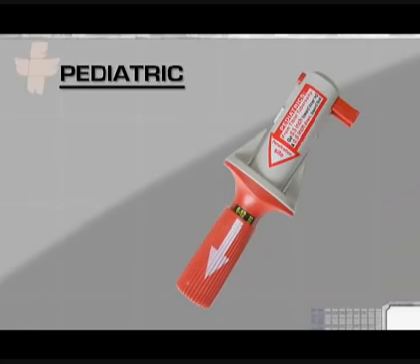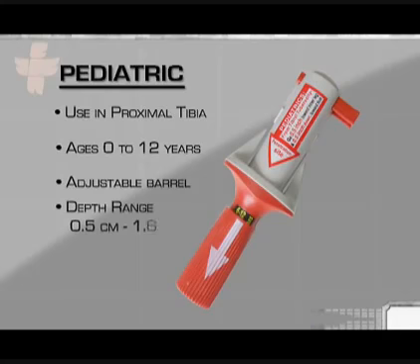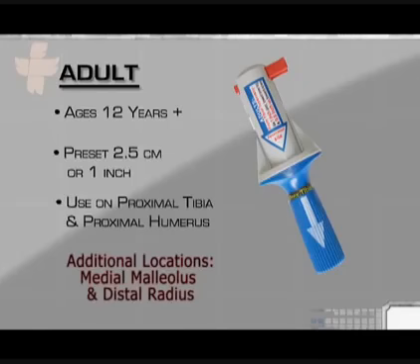The pediatric BIG is intended for use in the proximal tibia on term newborns to children 12 years of age and features an adjustable barrel to determine penetration depth according to the patient's age. Depths range from 0.5 centimeters to 1.5 centimeters. The adult BIG is intended for use on patients aged 12 years and up. It's preset to an insertion depth of 2.5 centimeters or 1 inch and can be used in both the proximal tibia and the proximal humerus.